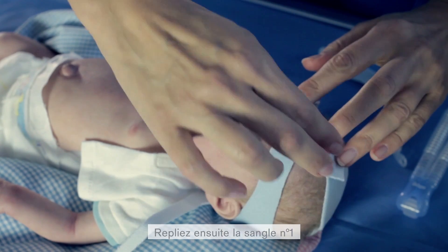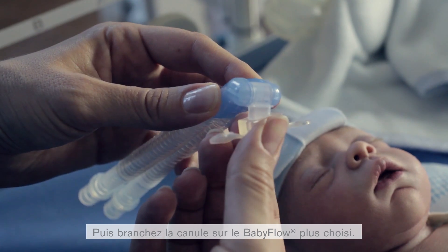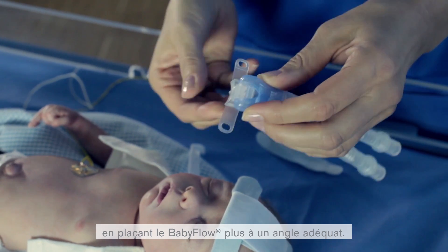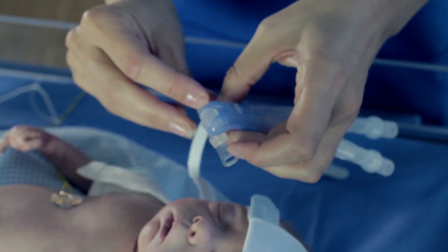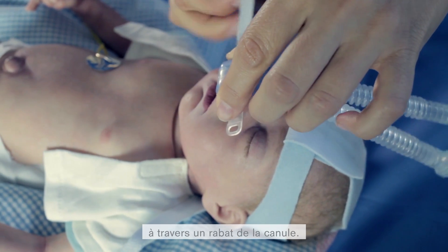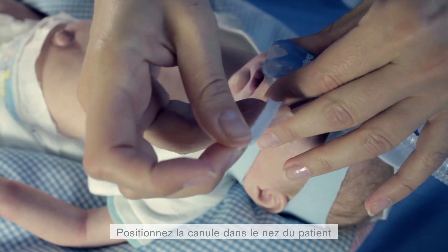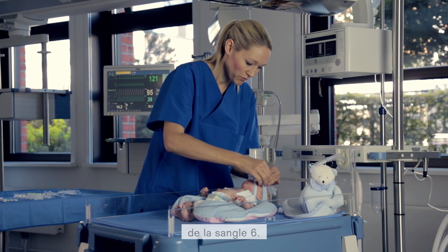Then fold strap number 1 back and ensure that it sticks firmly with the Velcro. Now connect the prong with the selected Baby Flow Plus. Ensure that you avoid putting pressure on the patient's septum by placing the Baby Flow Plus at an appropriate angle. Take time to adjust and find the best placement. Take the selected prong and thread the number 4 headgear strap through one flap on the prong, then thread strap 5 through the flap on the opposite side. Position the prong in the nose of the patient and secure the Baby Flow Plus safely on the patient's forehead by using strap 6.